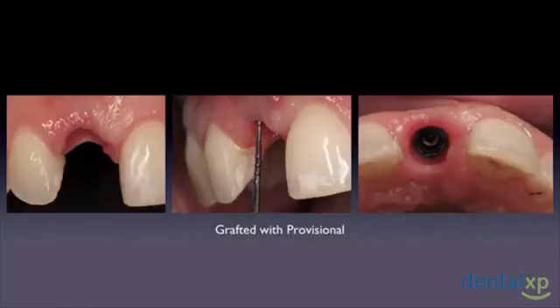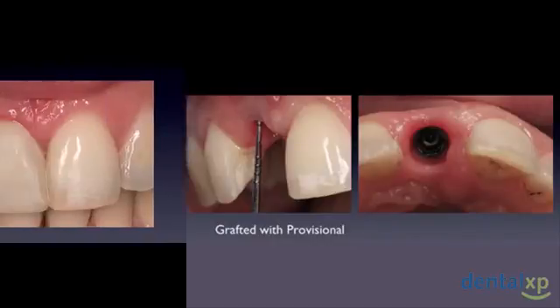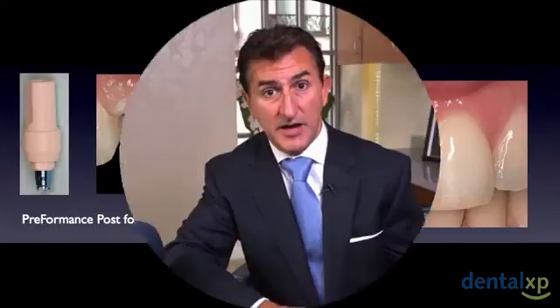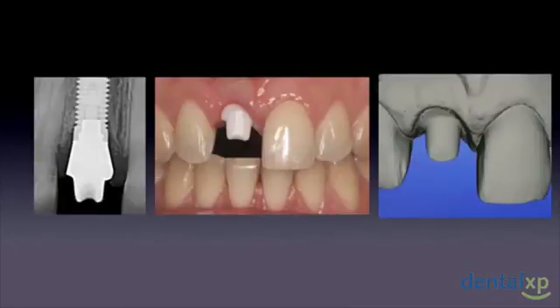Now the site is ready for our final CAD-CAM abutment. You can see how the tissue is healed, the proportion of the abutments is in a perfect position, and now we can actually scan our CAD-CAM abutment for milling of our final restoration. Once we've scanned our final abutment, we use a correlation technique of the provisional and the healed tissue to make a perfect tooth that matches the original provisional.